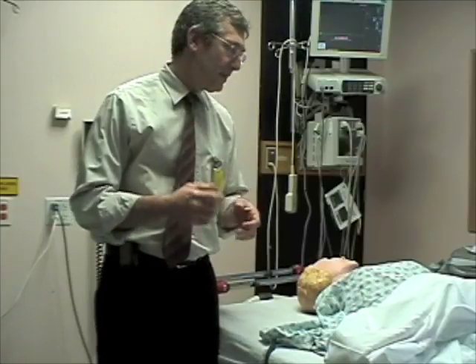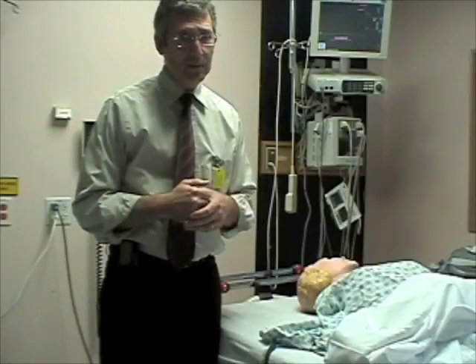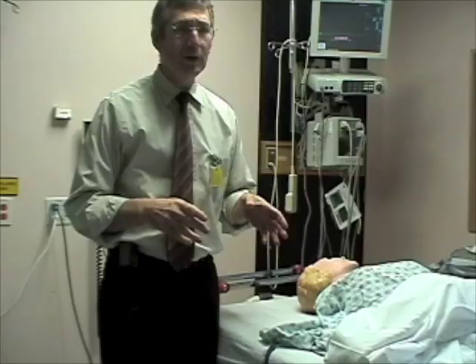Preparation of equipment: the nurses are expected to bring in the equipment for you. The best thing to do is prepare a time with the nurse so that he or she can work with you to make this the most efficient process possible. They should bring in the central line kit — they'll know exactly the right one to bring — as well as all the draping.